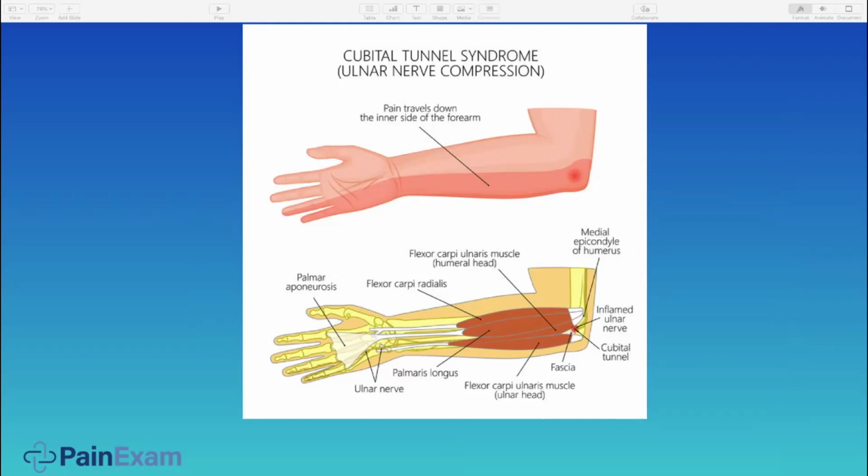And the orthopedic surgeon is taking the nerve and moving it outside the tunnel. When you're treating postoperative pain from this, which I see, you need to remember the ulnar nerve is not in the tunnel, or it's not where it should be. So you need to look for the ulnar nerve. And one way to do that is just trace it.